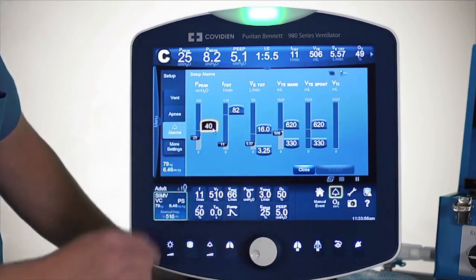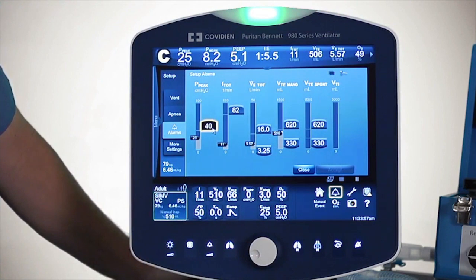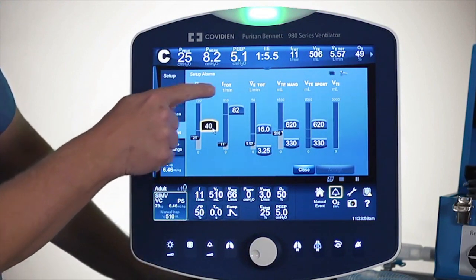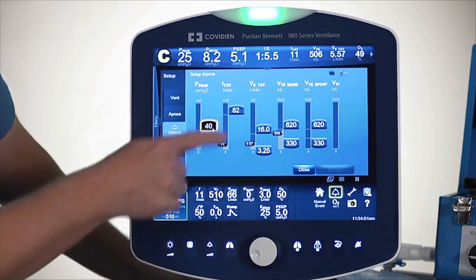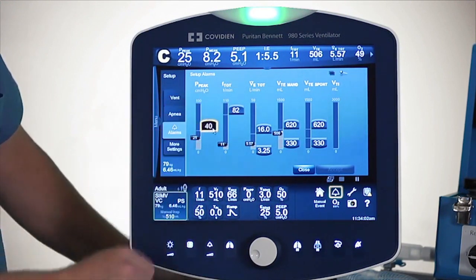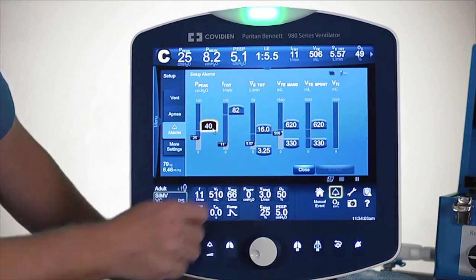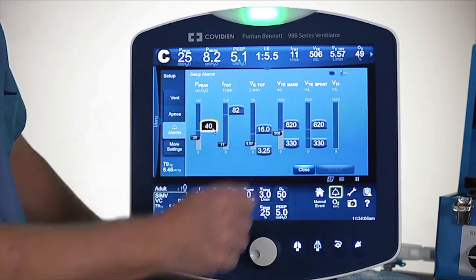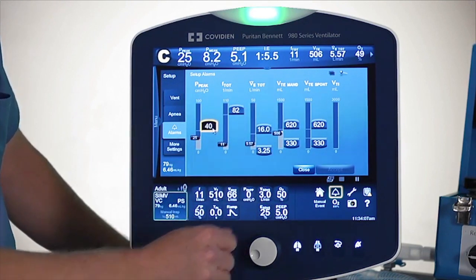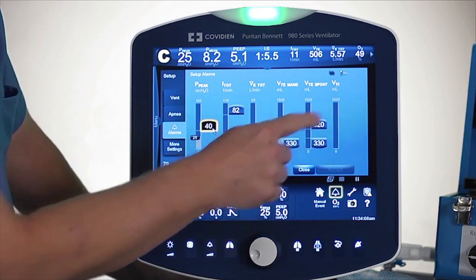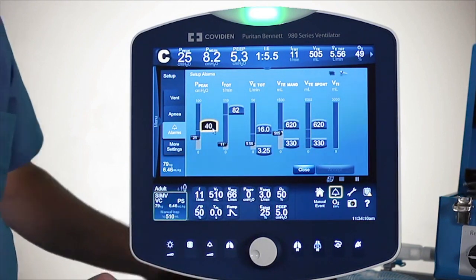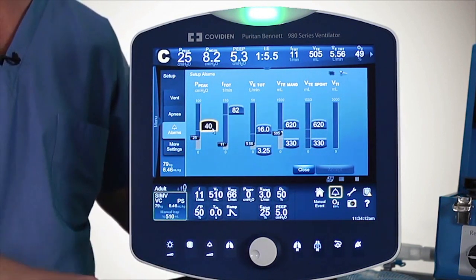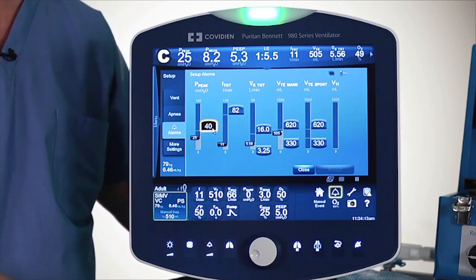The first parameter is a high pressure limit or P-peak, then you've got high frequency rate, minute ventilation, mandatory tidal volume, spontaneous exhaled tidal volume, and high inspired tidal volume alarm limit. Sometimes you'll find specific alarms with certain types of ventilation.